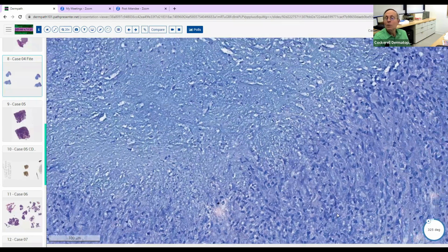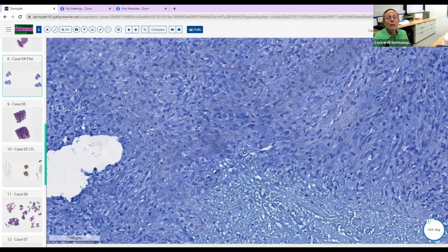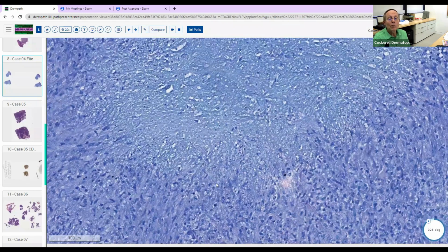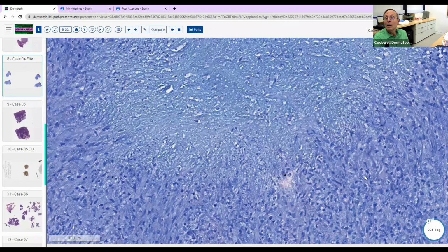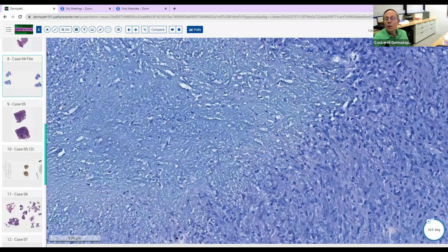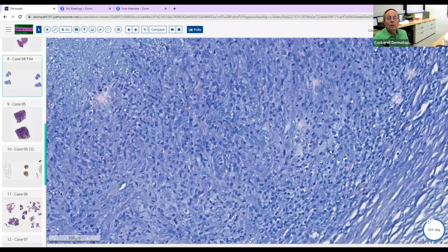And you say, well, gosh, you should think you see quite a few organisms, given that it's an infectious process, but you may not. You may only see one or two. So I don't see them here either. And we could spend the next 10 minutes scrolling around trying to find one. But I would say go back and look, and if you look carefully and spend some time with it, you'll probably find one, because this definitely was an AFB infection. So it's a good example of that.